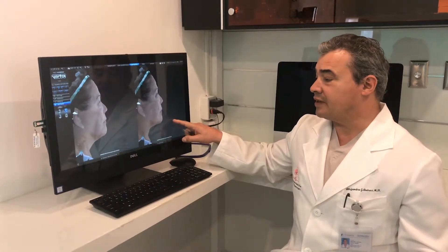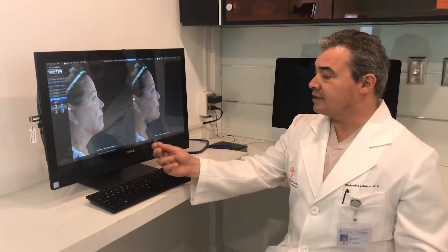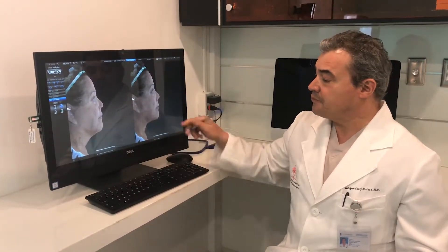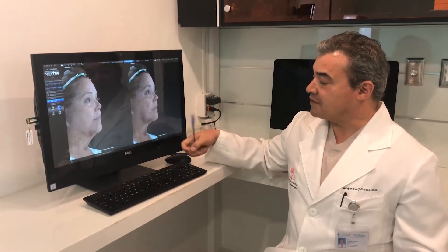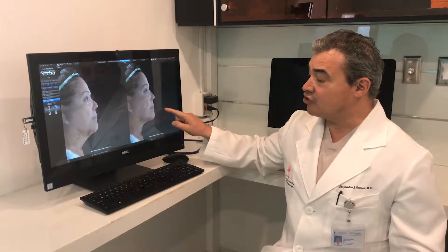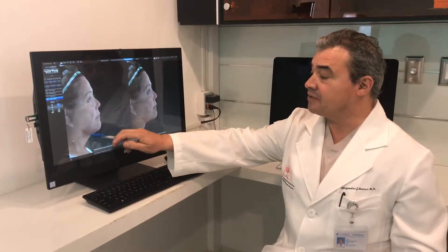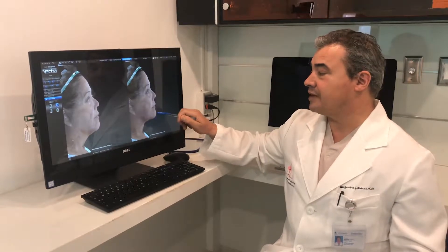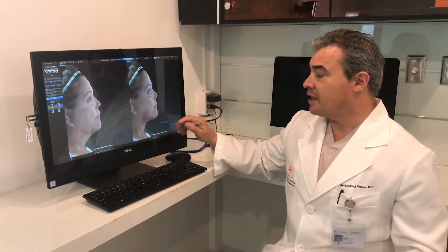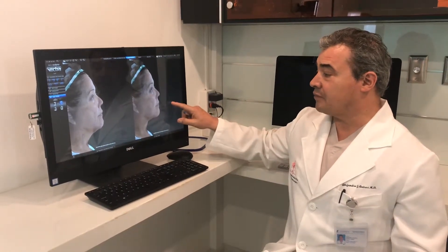We have a case here where one of the important things to point out is your neck — you start developing what is called platysma, the muscle contraction here, and you start losing the sharpness in your neck. So we can modify the angle of the neck a little bit with the computer after we've seen the patient physically, giving them a visual idea of what is going to happen.